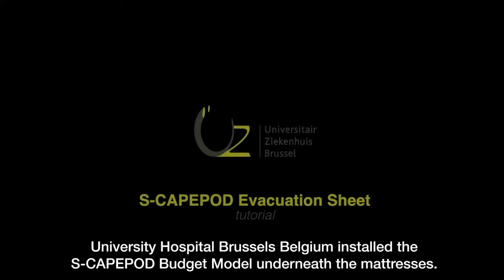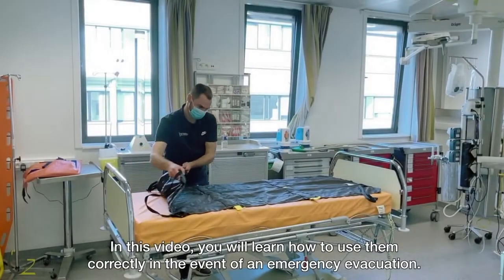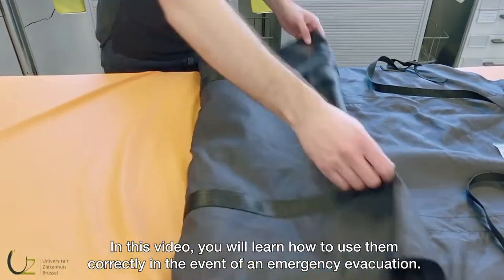University Hospital Brussels, Belgium installed the S-CAPEPOD Budget Model underneath the mattresses. In this video, you will learn how to use them correctly in the event of an emergency evacuation.